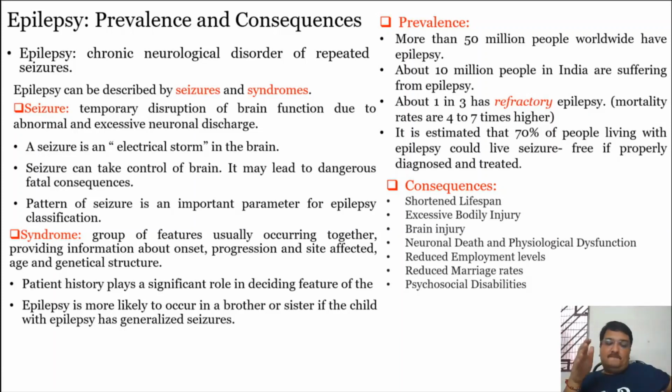So, in that case, why is EEG advisable? Because anyway, when a seizure happens, you won't be able to get the EEG which you want. But there has been evidence in the literature. It has been known that in between two episodes of your epilepsy, your EEG, your biopotential, will provide some of the information about the epilepsy and the type of epilepsy.